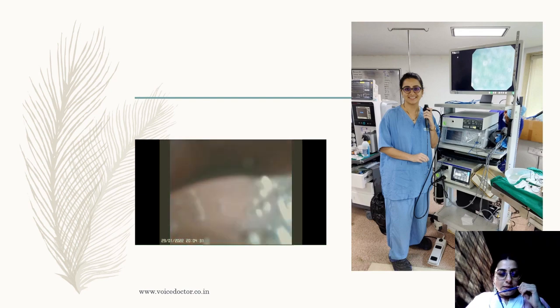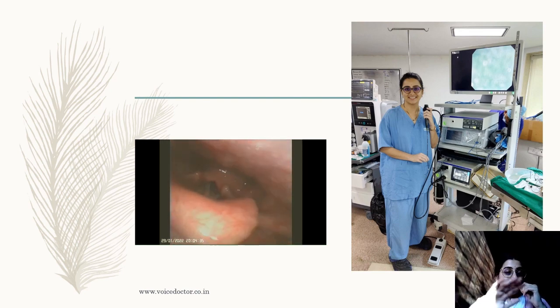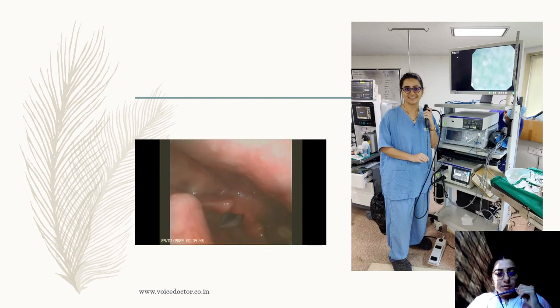This is the palate area. This is the tongue area. See, while I'm entering, I'm also inspecting and seeing whether everything is okay. This is an epiglottis, or the small tongue. So this is the larynx or the voice box. This is the food pipe area.